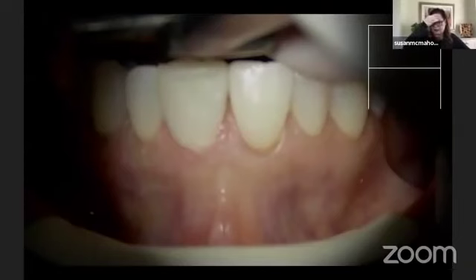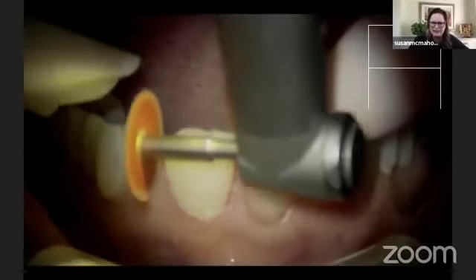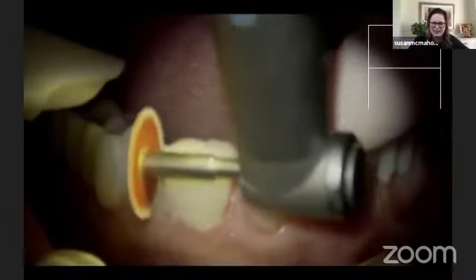So I've got the composite on it. I did it the same way, using just two colors of composite, a translucent and a body shade, and I'm ready to start to finish this tooth. I've got a basic shape going. These videos I shot with my new microscope, so they're not perfectly in focus, but Glenn, next time I'll figure out how to make it perfectly in focus. The first thing I'm going to do is take that disc and very lightly get those line angles. I've got to create corners with that. Then we're going to flip it around and do the other side. Same thing.